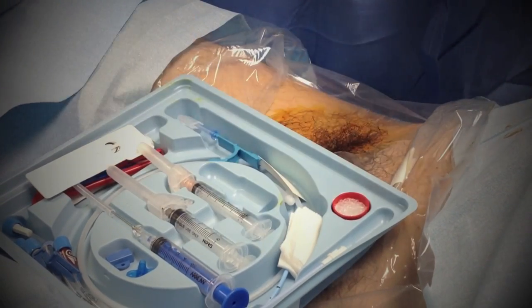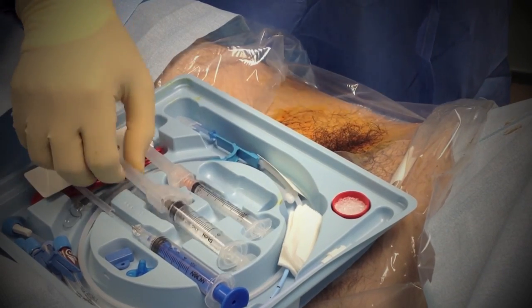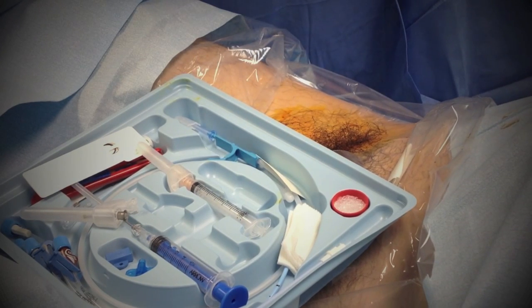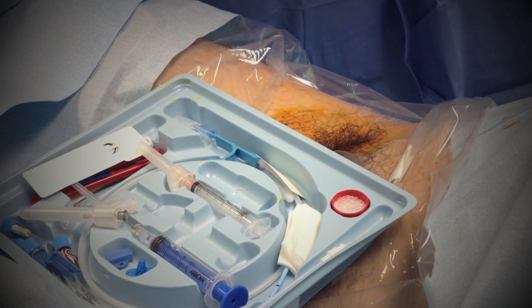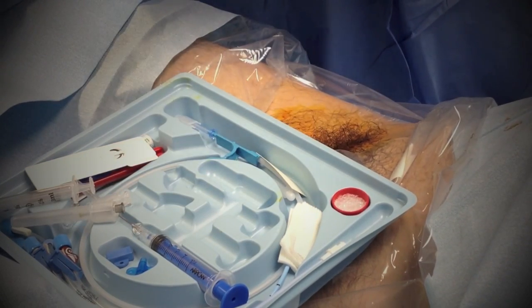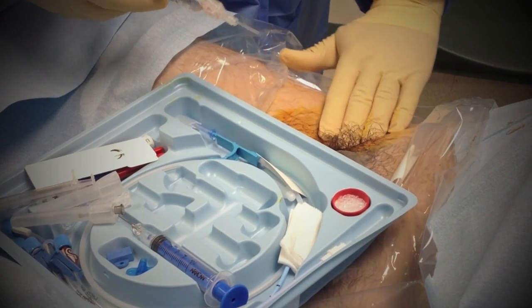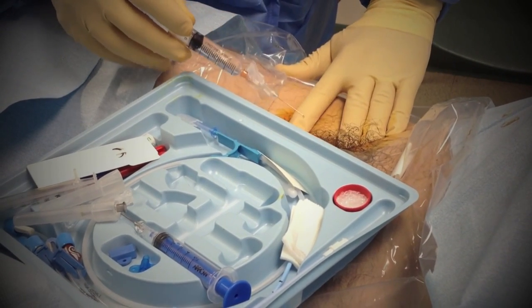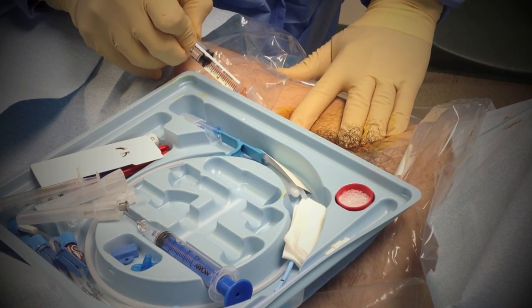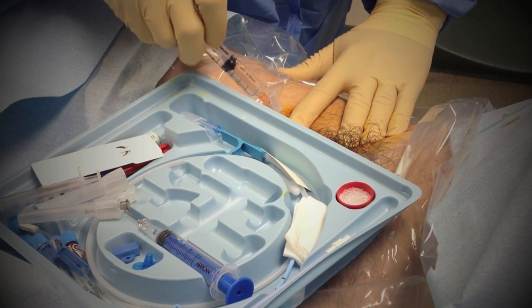First thing we're going to do is numb. So we grab some plain lidocaine — this is the numbing medicine. A little pinch. I will follow that same track and do plenty of it.